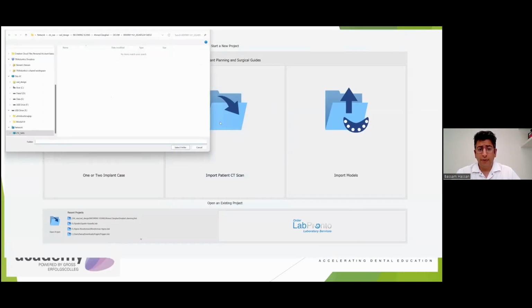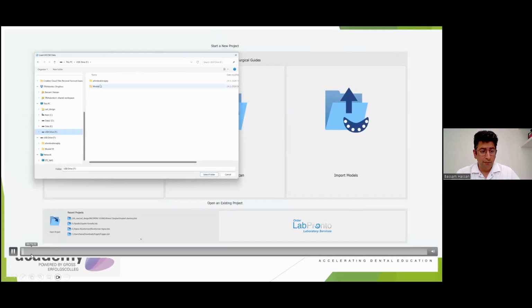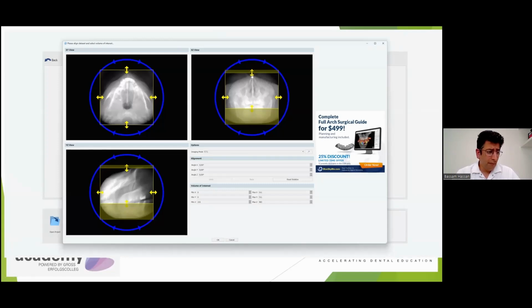So in that respect, I'm happy to say that there has been some improvement in which the scanners improved their imaging technology to a point that you could actually reduce the metal artifacts. But, and this is the example I'm showing you, and this is not from 10 years ago.